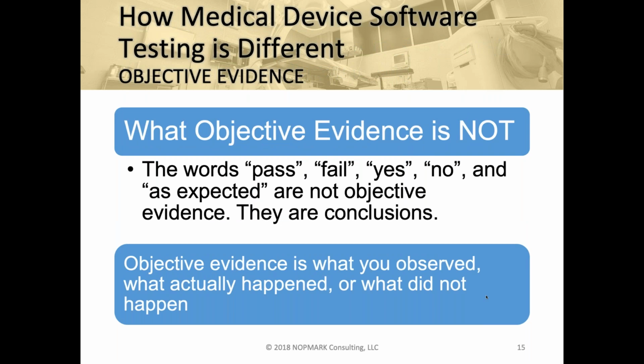So I keep talking about this word of documentation and providing the evidence. So this is where the rules now start talking about, well, what is evidence? When I say evidence, what does evidence mean? Sometimes it's easier to say what evidence is not.